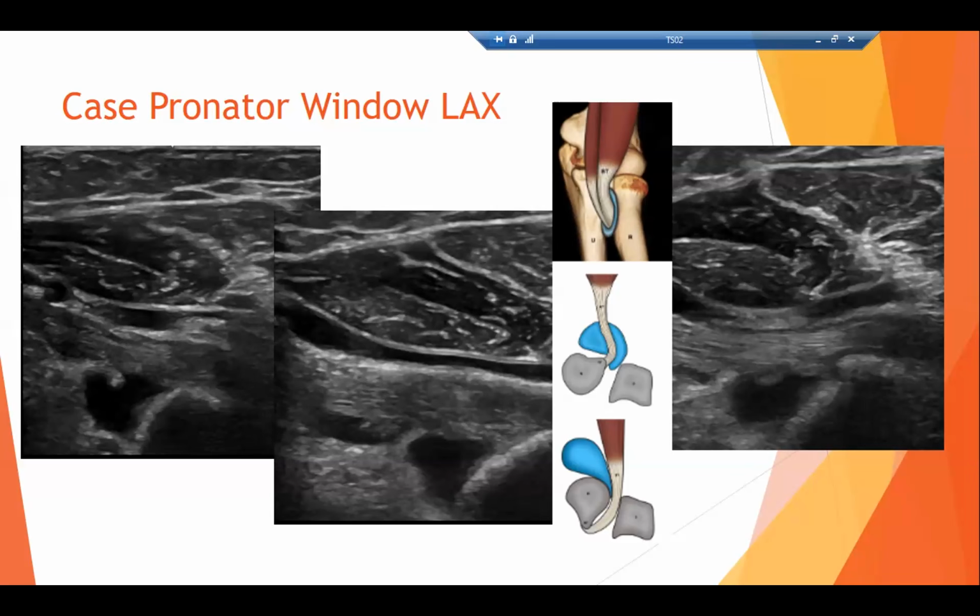We just had a sports conference yesterday. And even the case that Dr. Hasley presented last week about the cortical irregularities over the scaphoid and the FCR: is it an abrasive problem, or are those cortical irregularities secondary to chronic inflammatory changes? It's hard to know. I'd be curious what some of the other folks who scan a lot think: is that radial tuberosity osteophyte or irregularity a secondary change, or is it a primary problem that leads to the secondary change? That's just one question I always have when I see these irregularities at the tendon insertion.